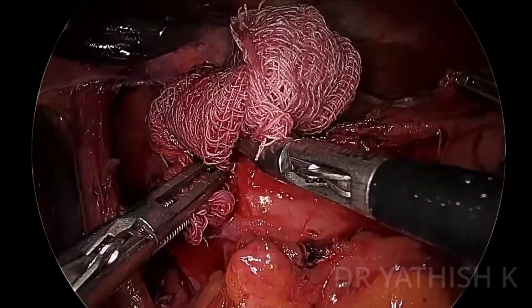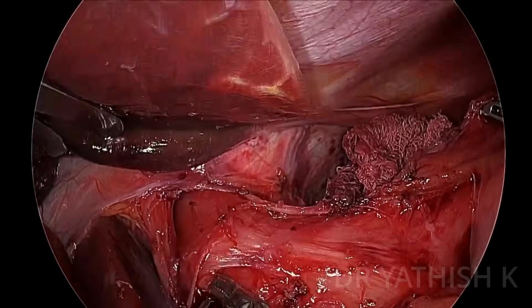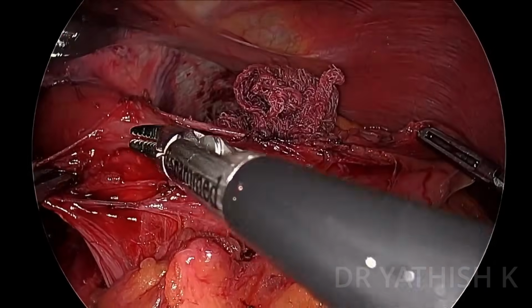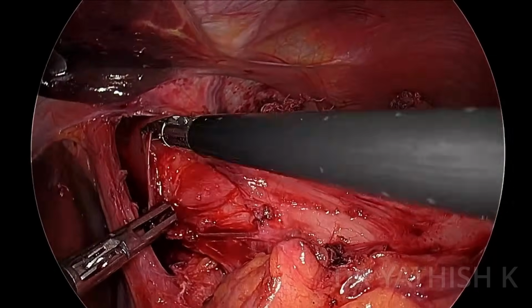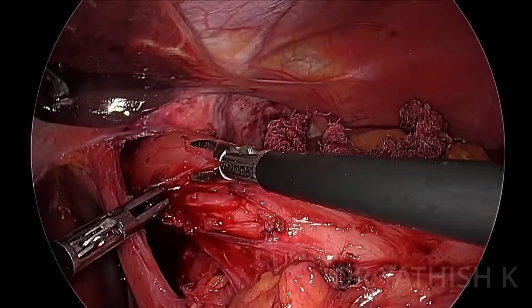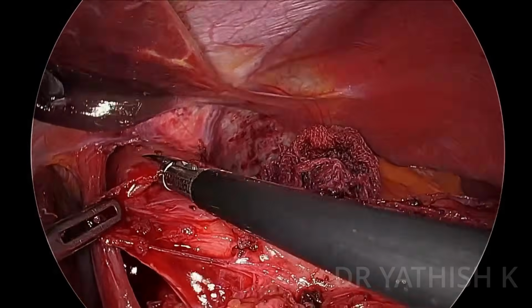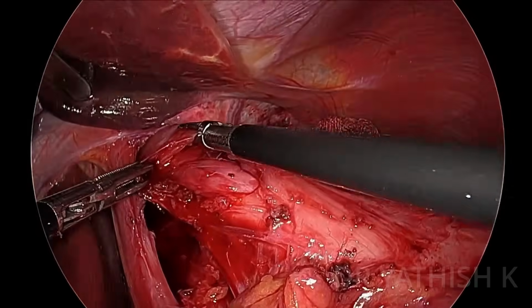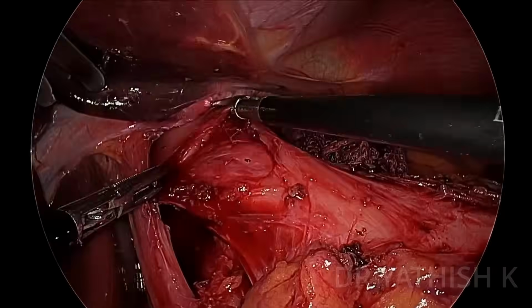I generally use a Maryland and a grasper. If you have another extra Maryland with you, it'll just help you out. Over here, I'm slowly doing my myotomy by dissecting the muscle fibers, those longitudinal and circular muscle fibers. As this case has already had esophageal dilatation done twice, I was expecting a bit of fibrosis, but I think I'm lucky enough that there's not much fibrosis seen.